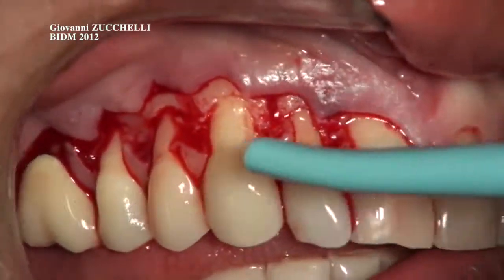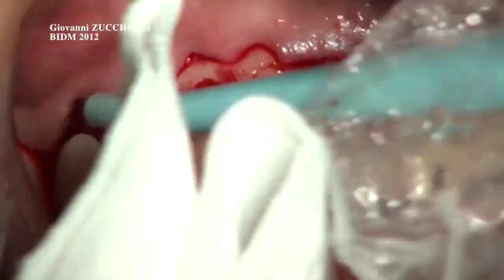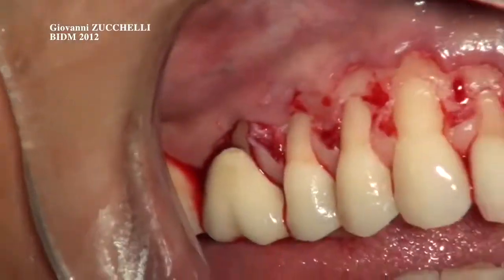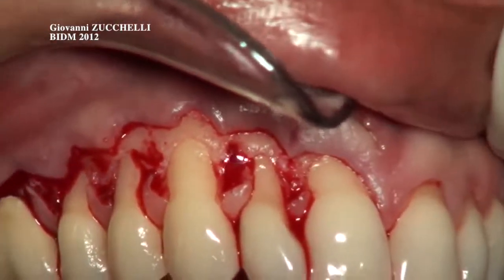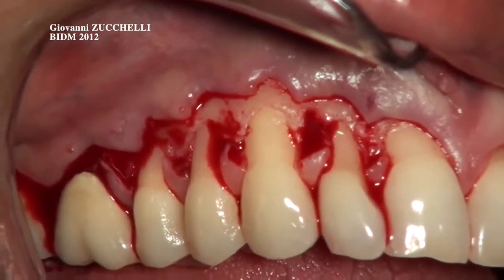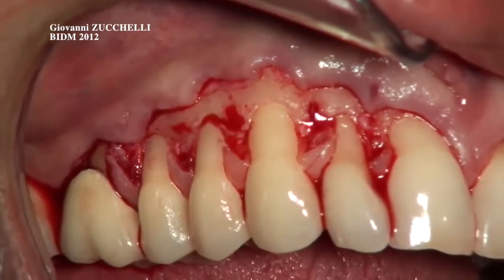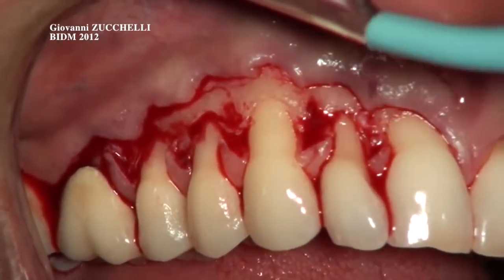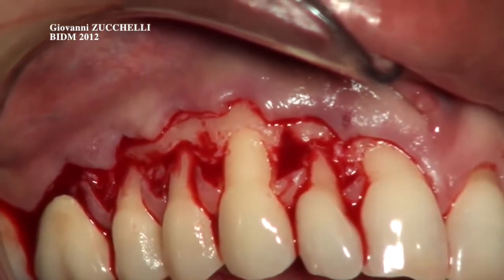If you look at it in this aspect, you can see that all the roots are now quite white instead of being yellow, which means that the demineralized portion has been removed. Now it's time to prepare the anatomic papilla to welcome the surgical papilla.